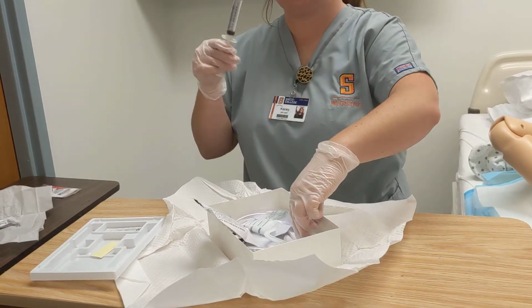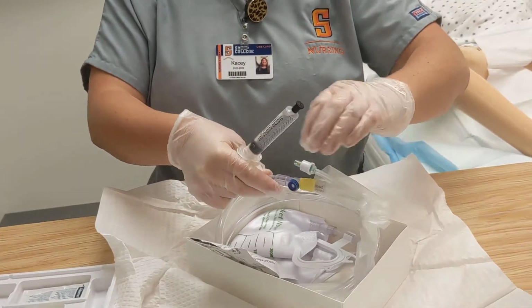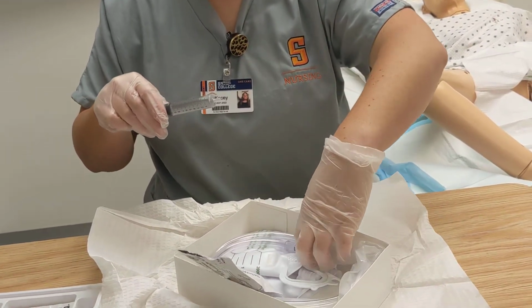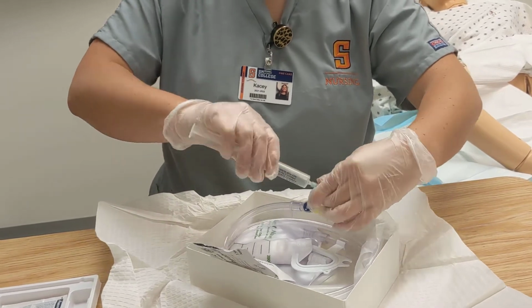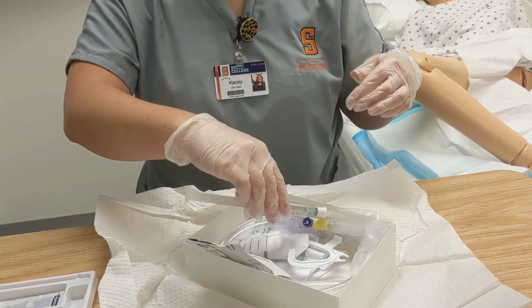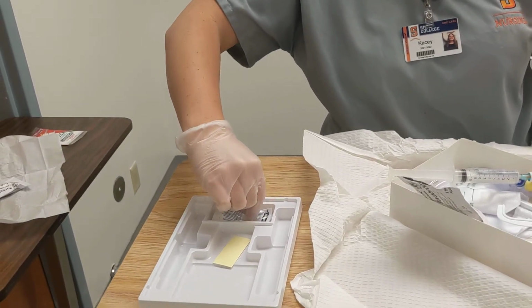I'm gonna hook this up to our Foley. Take the cap off. Hook that on good. Okay, and then we're going to get our jelly.